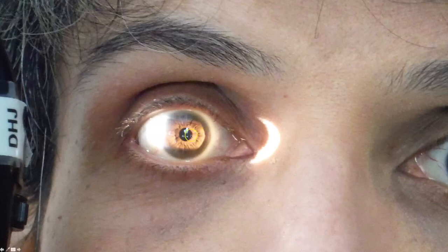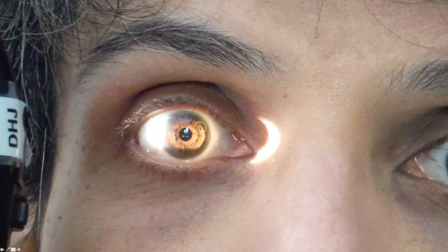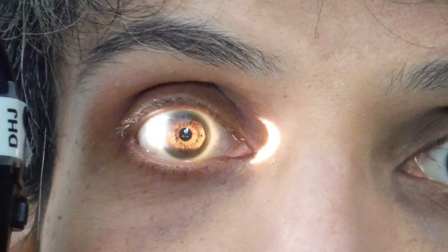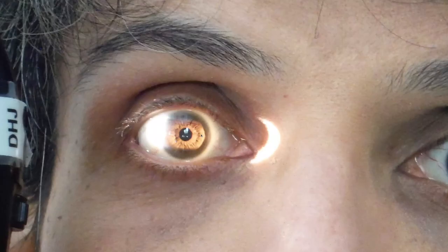If however the nasal iris were in shadow, that would imply that the iris is bowed forward out towards you anteriorly, and that it would be unsafe to dilate this pupil.